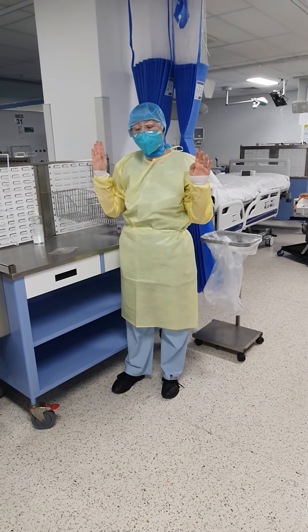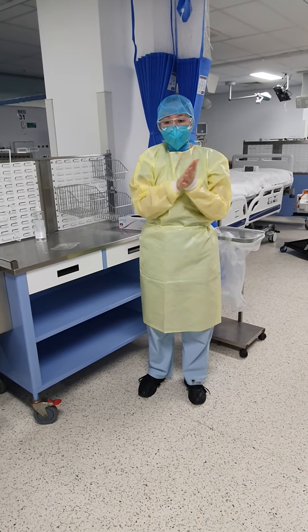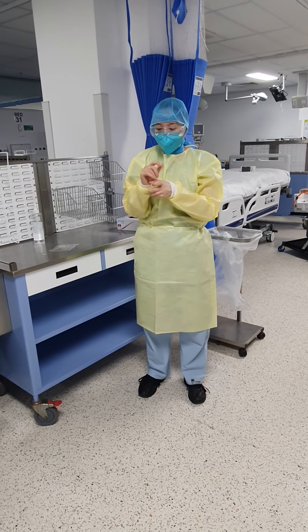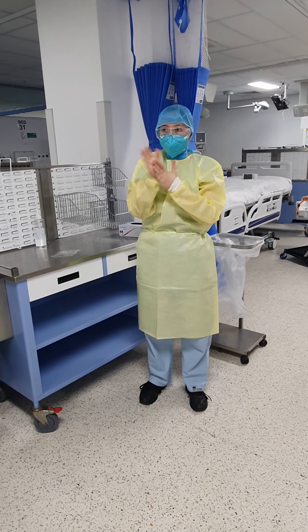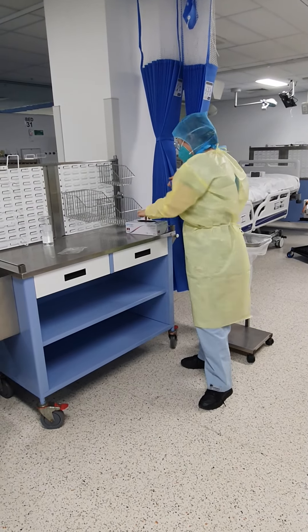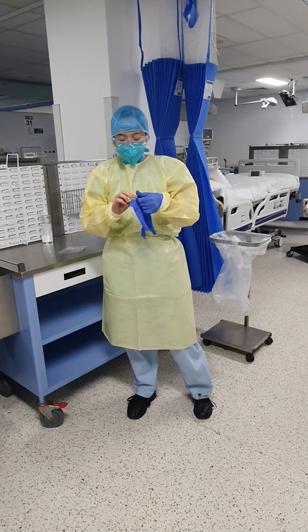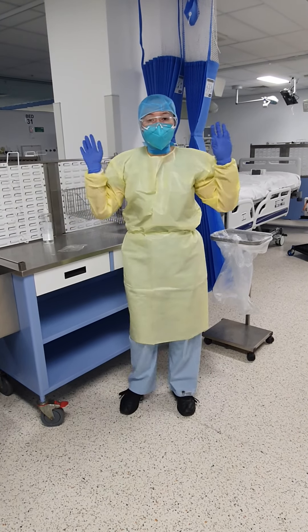Perform hand hygiene, rub it until it's dry, so my hands are dry, and then pop on some gloves. So now you're ready to see your patient.